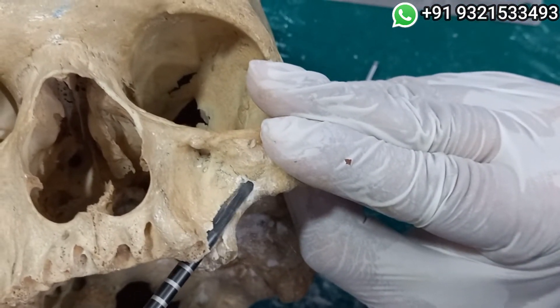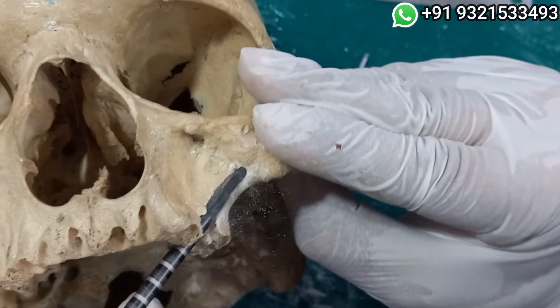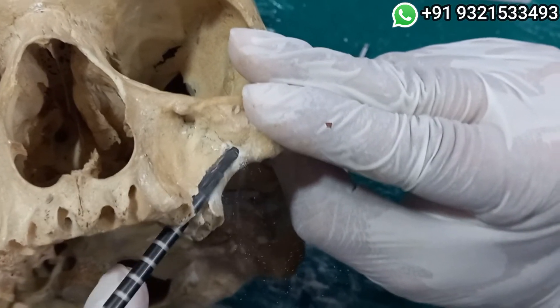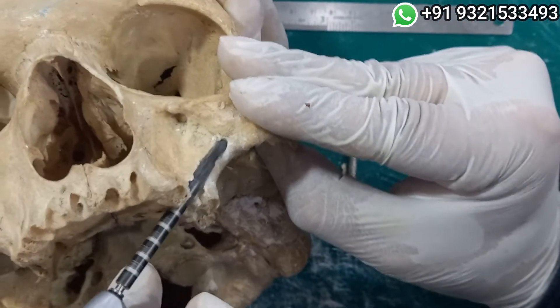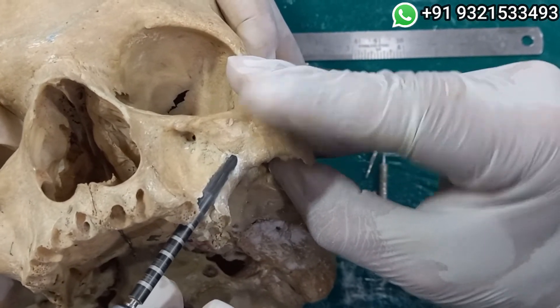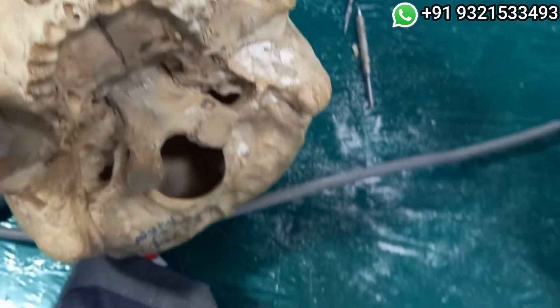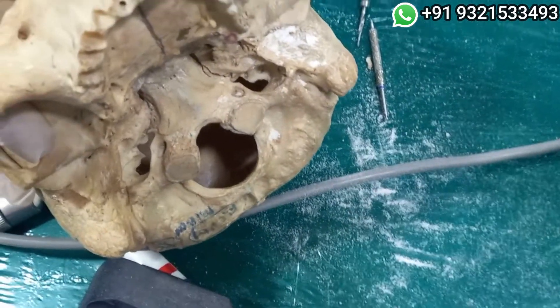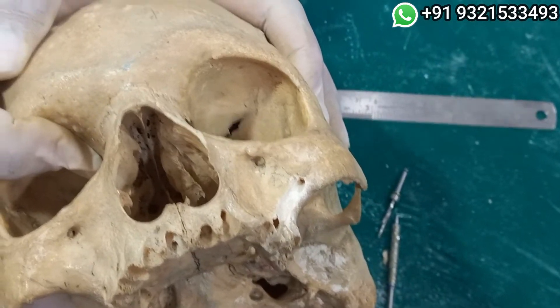With my pressure here — just hold the skull tighter please. It's producing a lot of heat; the handpiece has got really heated up. I will just check — one second, just hold on, I will check again.